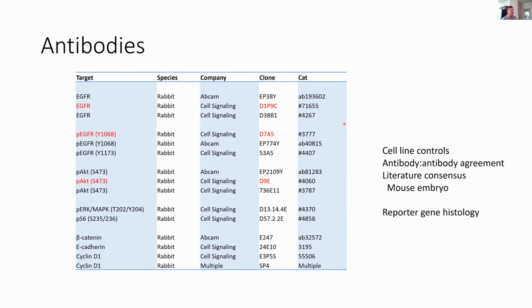And so, just to poll the crowd, Sandy, in your experience, do you have a favorite of each of these two? I don't know off the top of my head. Are your red ones your favorites? Mm-hmm. Yeah. I think that phospho-AKT in particular works really well on stuff like the PTEN knockout prostate model.